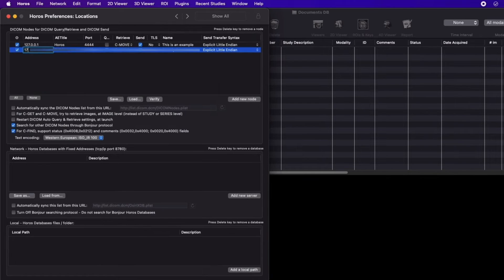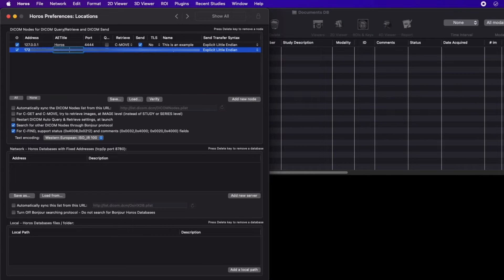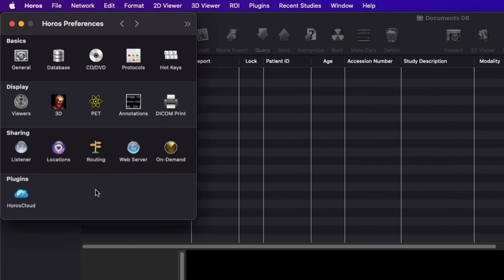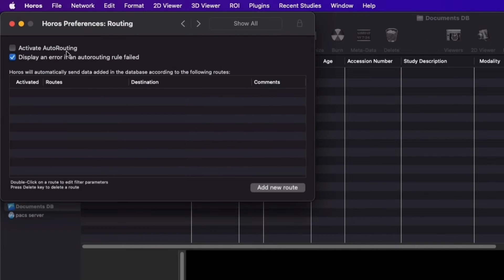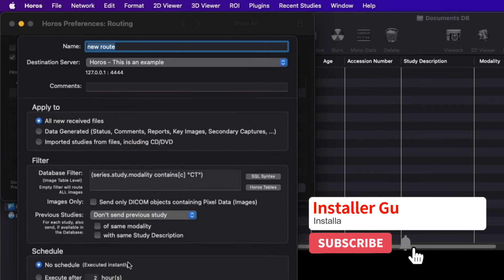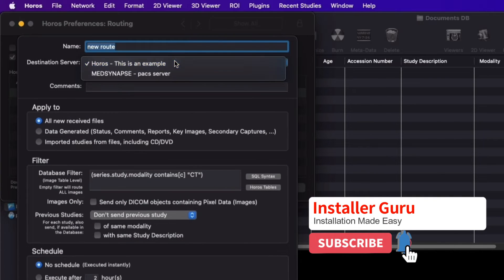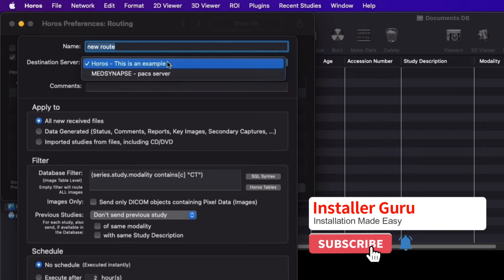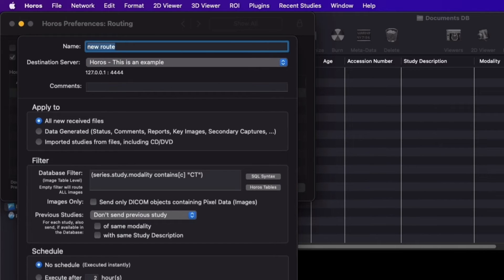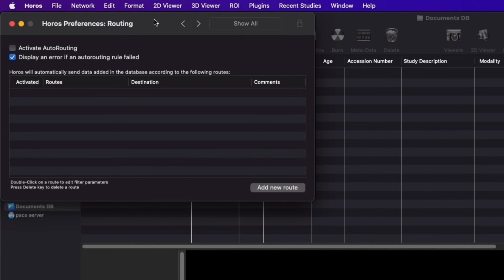In the locations menu, you can add your PACS or modality address to receive and store data in the software. This software allows you to route downloaded images to another workstation or PCS system via DICOM auto-routing with various filters and a scheduler.